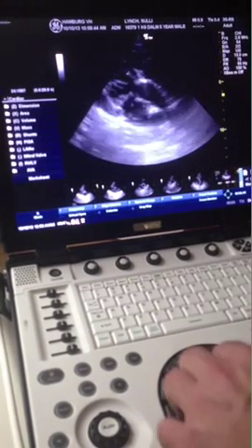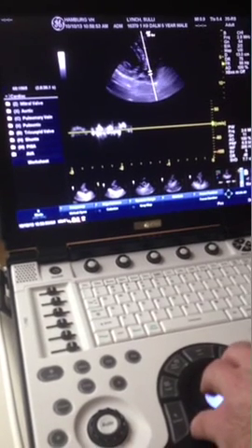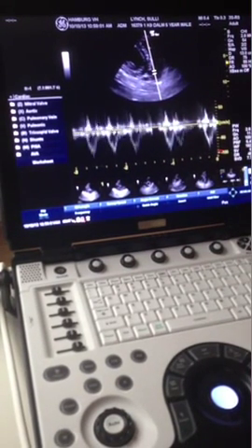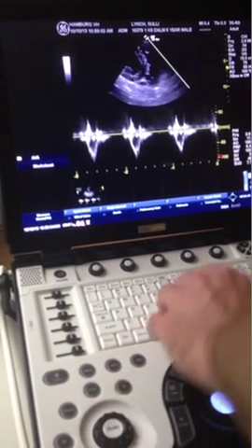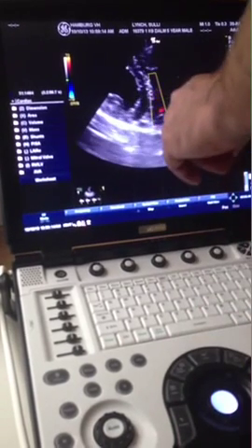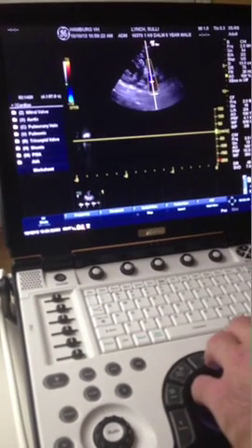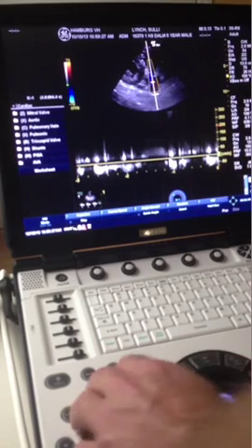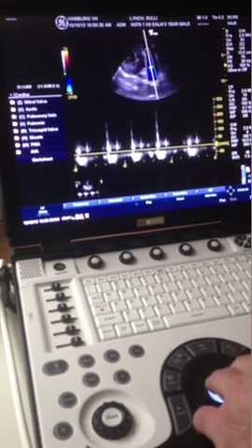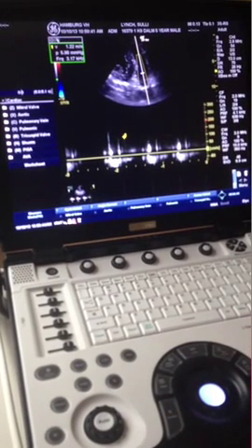From the right atrium position I'll bring the tail down and get the pulmonary artery, checking the Doppler right at the pulmonary valve. There's some insufficiency — this insufficiency has a forward jet, so I'll measure the forward jet. I'll put the color on over the valve. The insufficiency jet is red — red is towards the probe — so I'll go to CW right over the red jet. The CW will allow me to quantify. That's probably the best insufficiency jet there; it's not clinically significant.